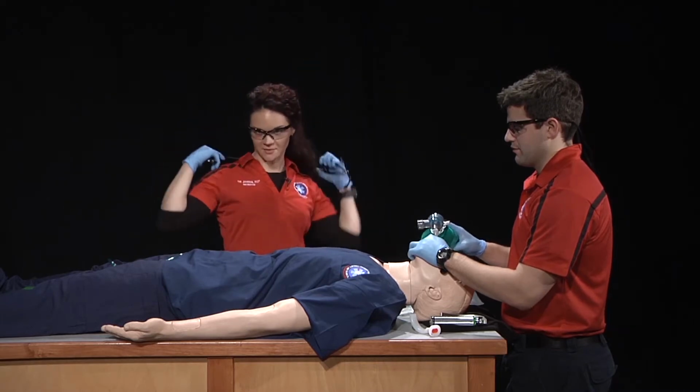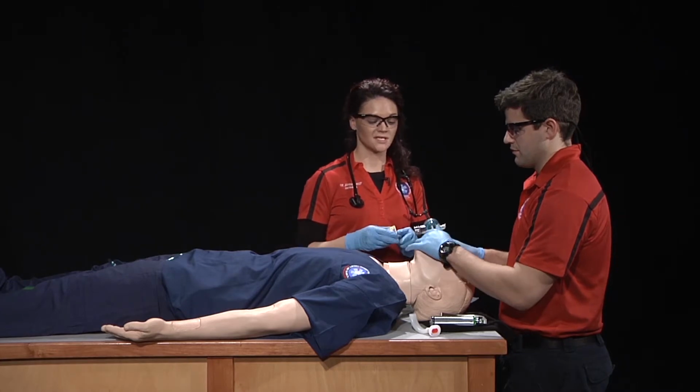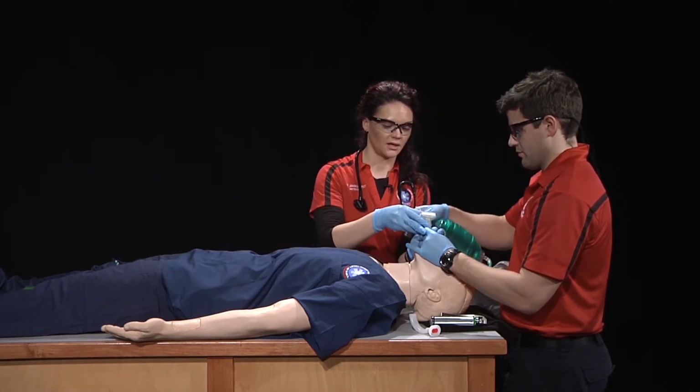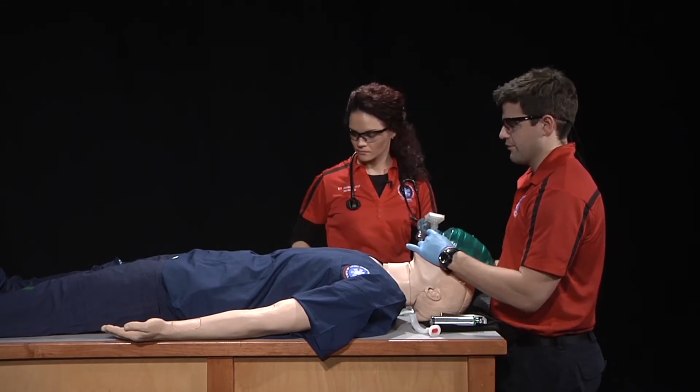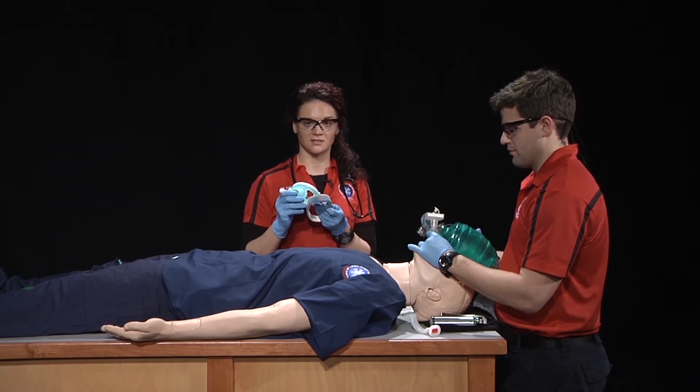After confirming placement, we use a secondary device to confirm placement. We'll attach the colorimetric device to the tube and resume ventilations. Now I'll take the securing device and secure the tube.